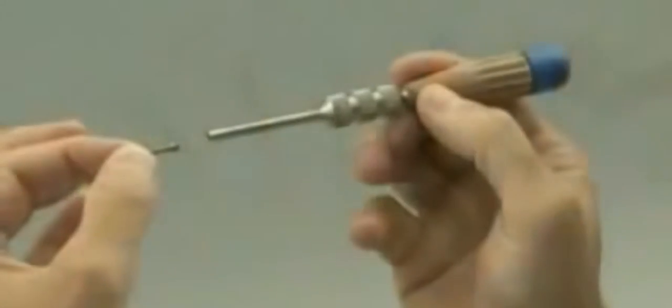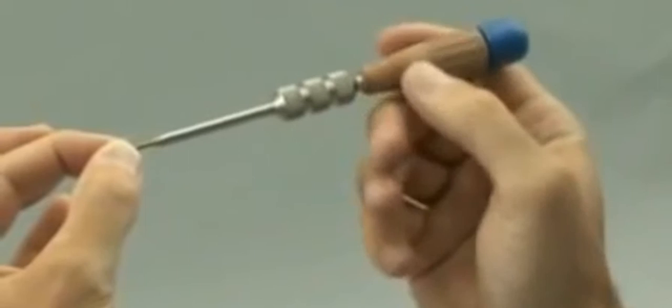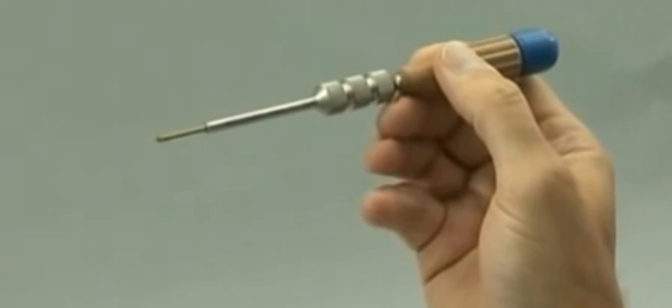A cannulated screwdriver with color markings to control the degree of countersinking of the screw. Before it's introduced into the bone, the 3 millimeter headless compression screw is attached to the compression sleeve by an internal thread that matches the thread of the screw's head. The compression sleeve and screw are connected together to form one instrument, which will allow the surgeon to use the headless compression screw as a lag screw.